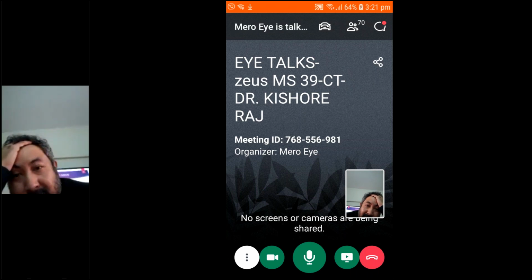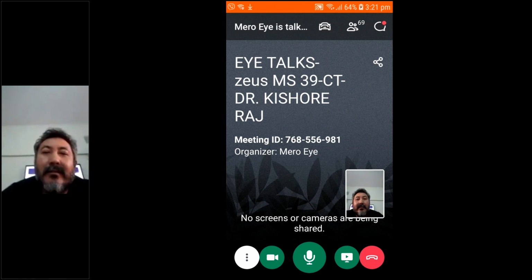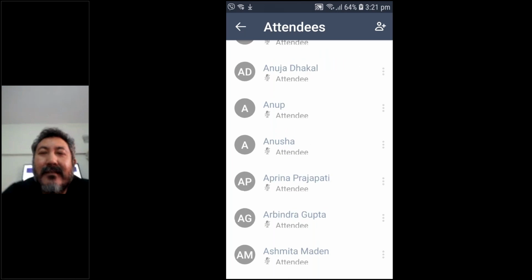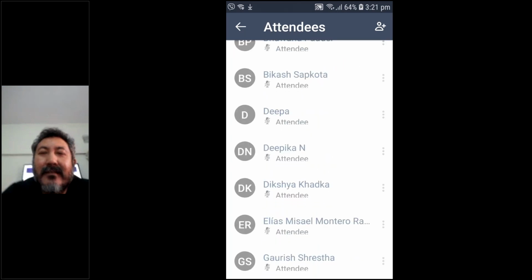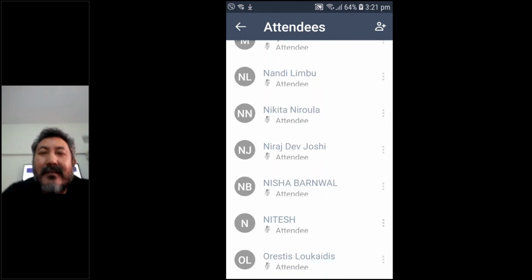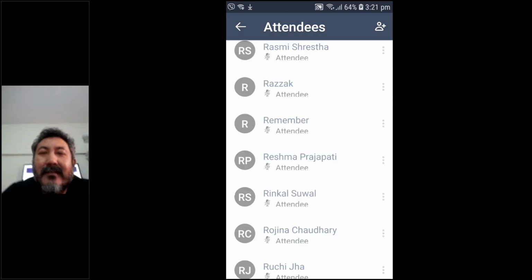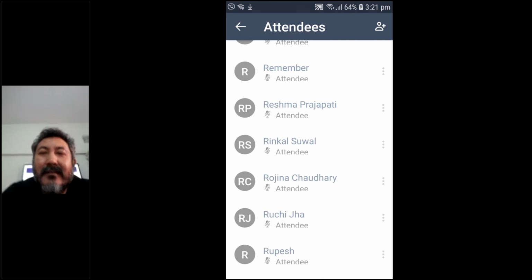There is one question from Gauri, sir. Thank you so much, Gauri sir, for your question. He is asking which type of aberration you really consider important for screening a patient undergoing refractive surgery. Vertical coma and spherical aberration. Okay, vertical coma is important.